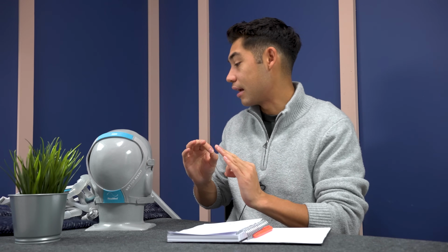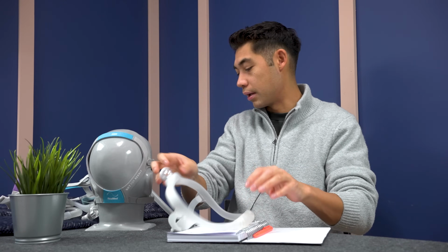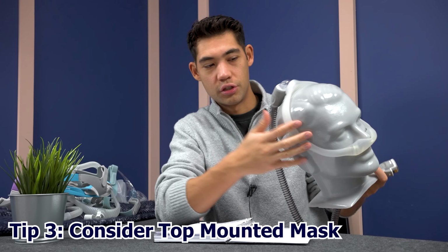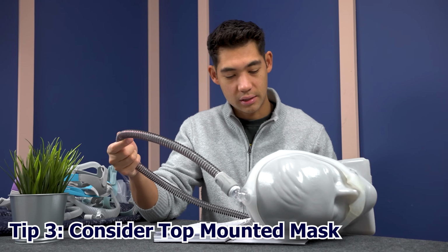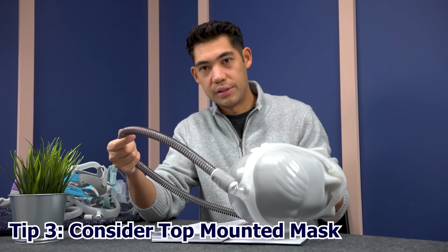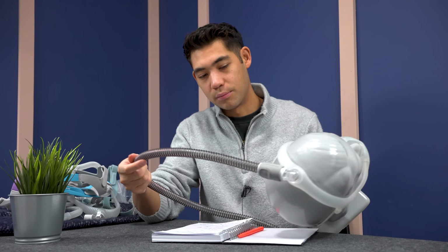The next thing is you might want to consider a top mounted mask. That is because, okay, here we have a top mounted mask. Here it is, also sometimes called a hollow frame mask, and we have a tube here. So as you slide around and roll around on this side and then this side and then this side and this side, as you can see, the tube stays in place.